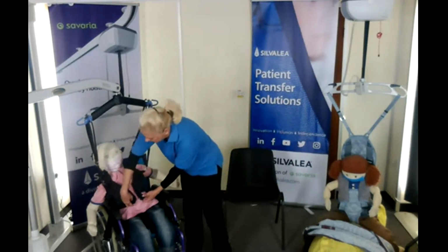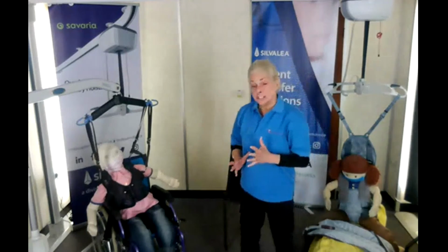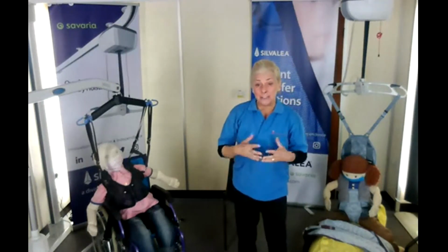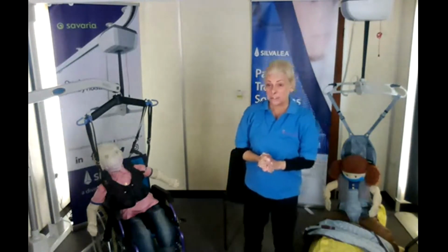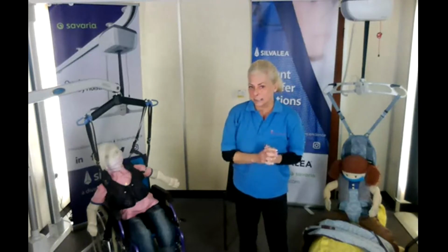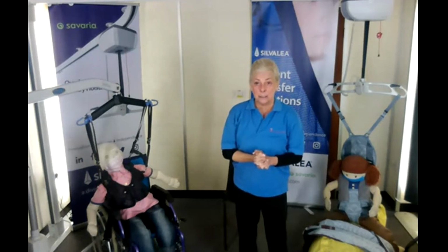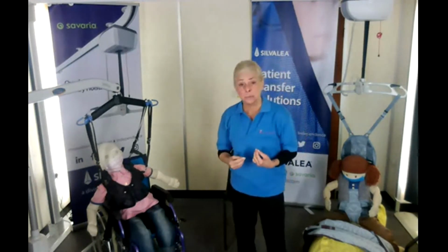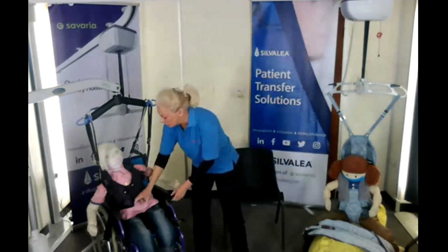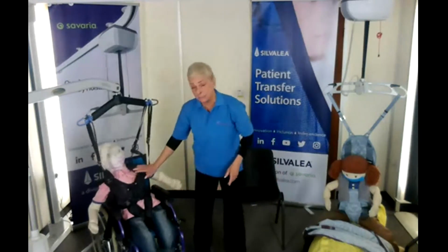Sizing is tricky. And I know that because of all the queries, because it's got to fit, you know, reasonably well. If it's too big, it's going to hang. But we have got a basic sizing guide on the website, and I would recommend that if the client doesn't fit exactly into the sizing on that chart, then you may need to have it custom made. But if you have any queries, please contact us and we will talk you through it, because you can't really allow for growth with this one, because it'll be too big and they'll be swimming in it. It won't be supportive. So I do think sizing is really important with that style.